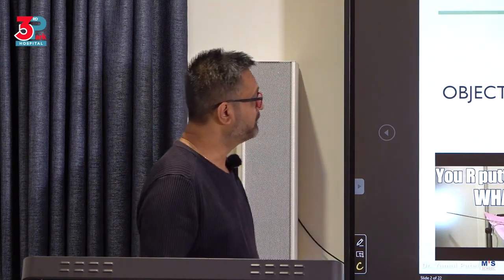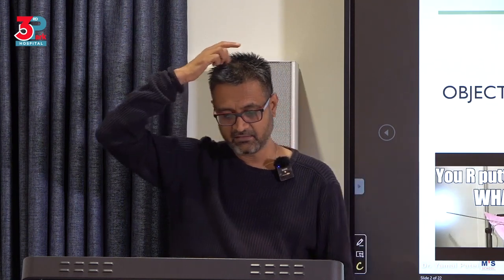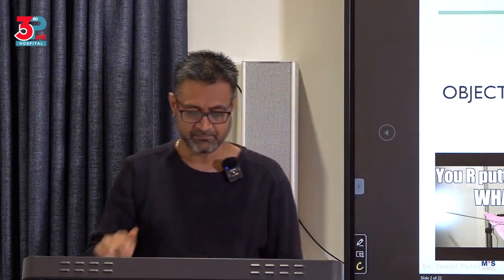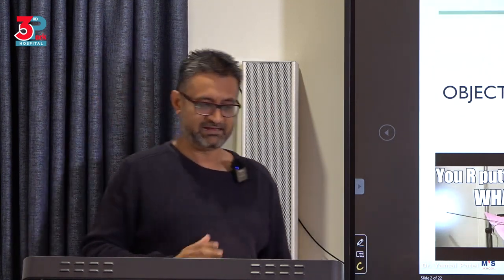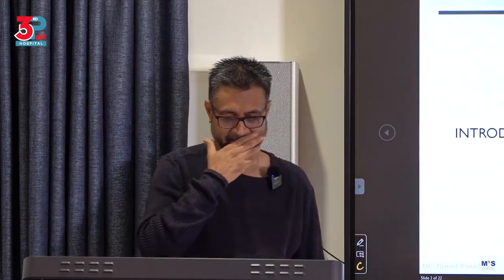So when we talk of the media that we use, we'll classify the media. We'll understand the properties and the use of the media. We'll see how to supply this media into the uterine cavity, so the media, the distending mechanism. We'll have to understand the guidelines of the various media and talk a little bit about complications of this media and how to manage it.